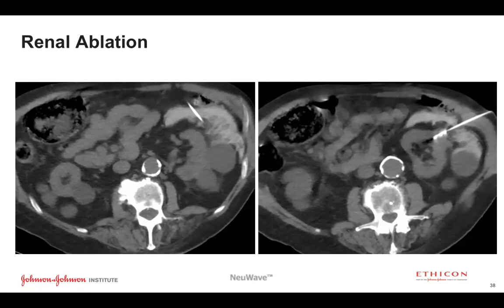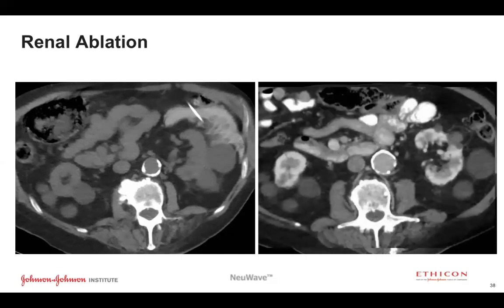But for those two reasons, I try to avoid poking the lesion directly, and I try to avoid a trajectory that's aiming at the collecting system. But you can see in some cases, you can't avoid it. And we take what we get, and usually it's not an issue. But sometimes you have to go through the tumor directly, and fortunately in this case it worked out great.